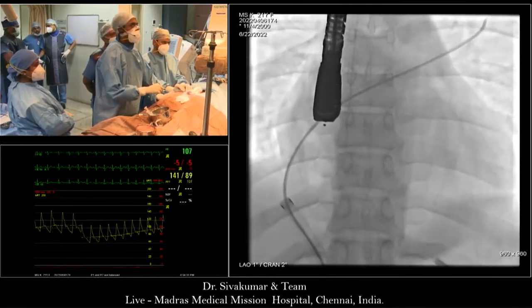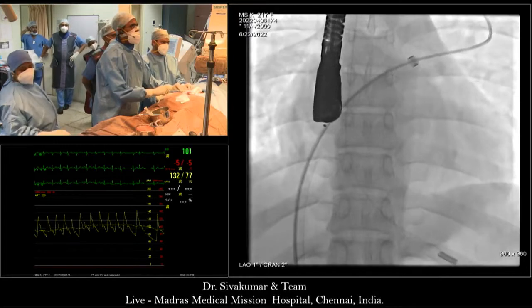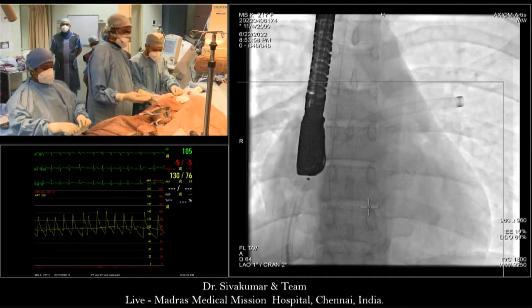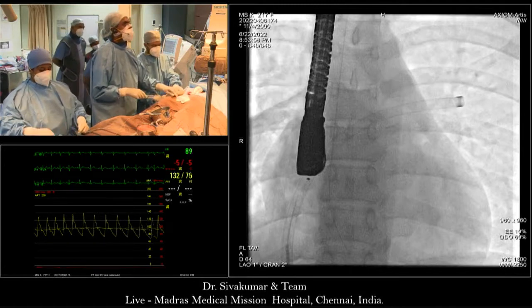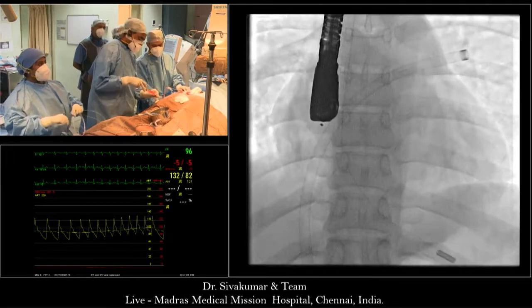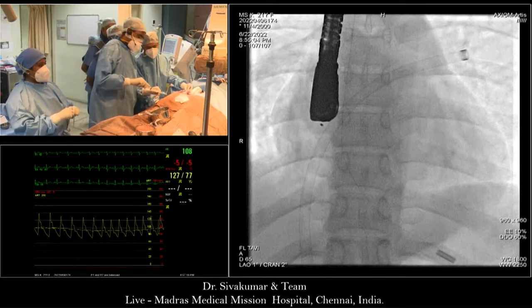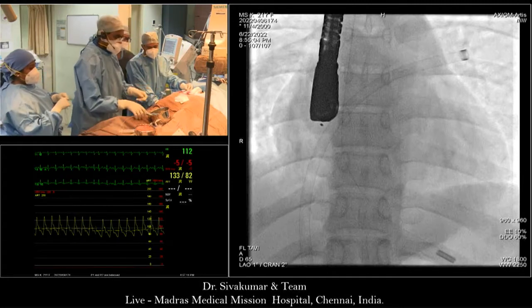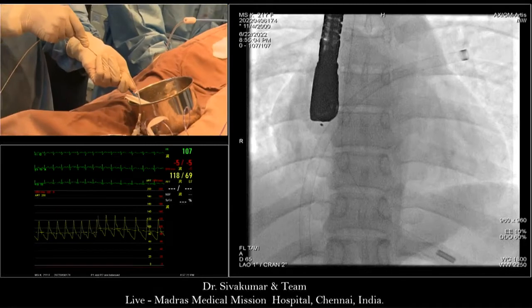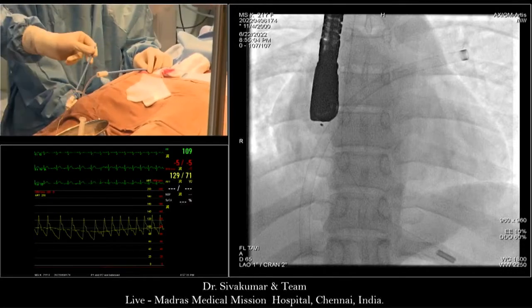Show the device. So we're not going to disturb you, Siva. You crack on, okay? And let's see what we get. Is it the same 40, sister? Sure? Not the 36 again? Okay.